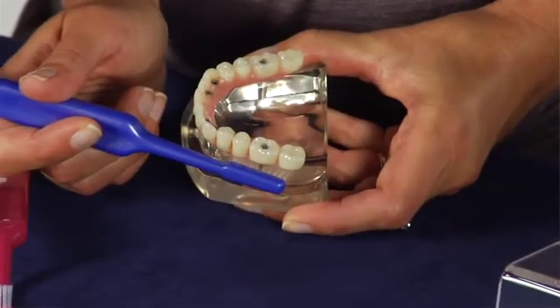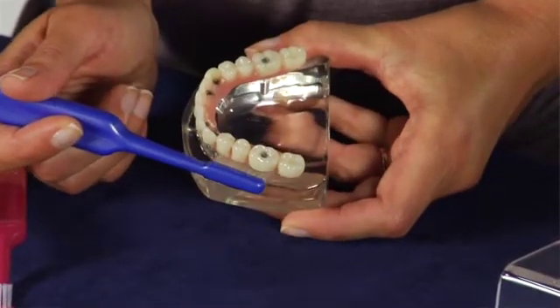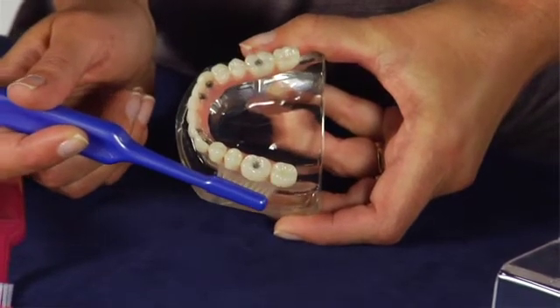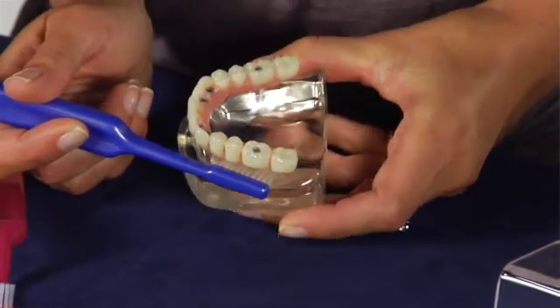It's of special importance to reach the area where the implant meets the gum tissue. But of course, crowns and bridges should also be cleaned to maintain a fresh oral condition.